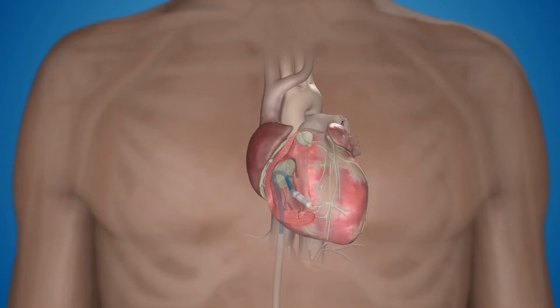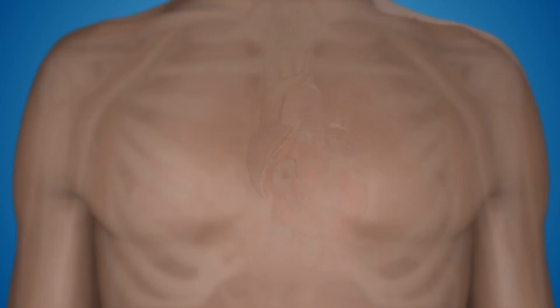During the procedure, Micra is placed against the heart wall and secured with flexible tines. This allows Micra to be invisible from the outside, and eliminates any leads, chest scar, or pacemaker bump under the skin.